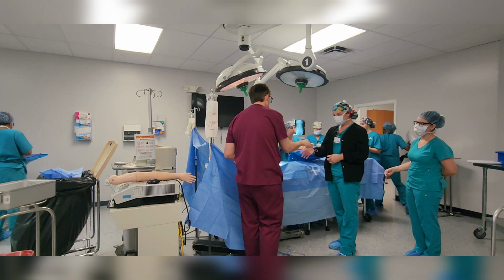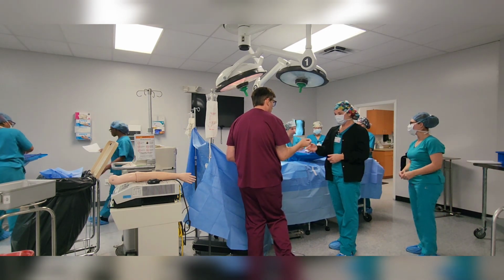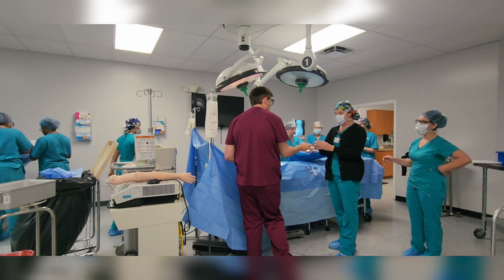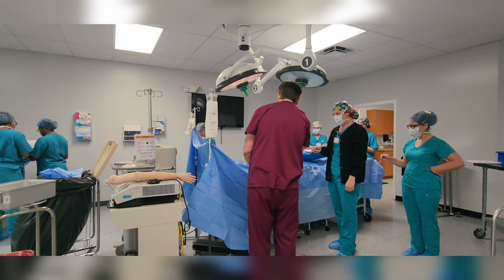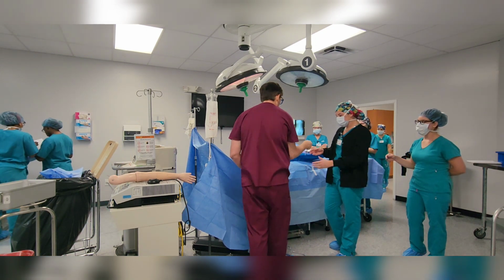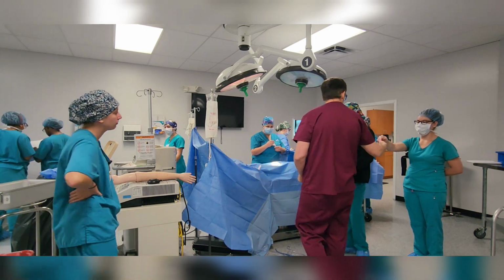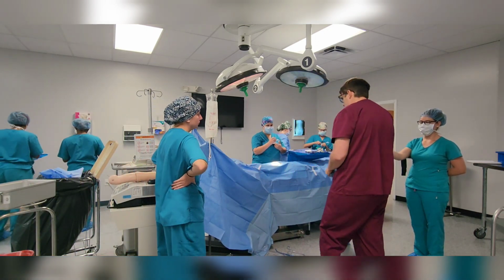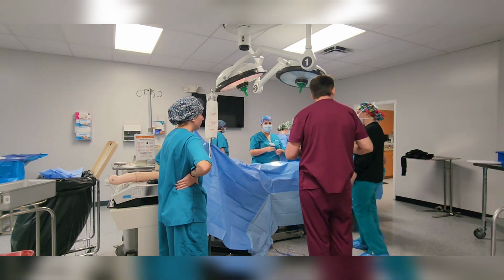Hold your hand out, so it dangles a little bit, click it once. You just gotta make sure you're feeling their hands there. It just feels weird in your hand, kind of dangling between your thumbs. You're just dangling it out. It's good. You don't have to be like, ah.